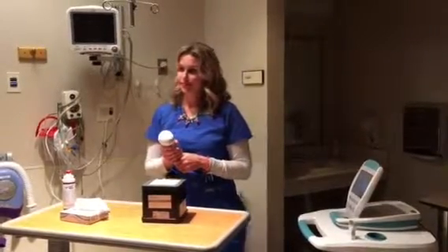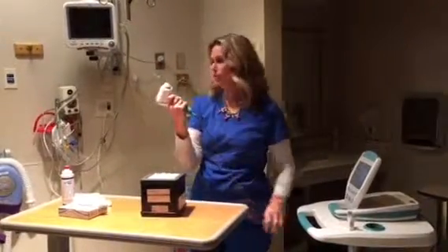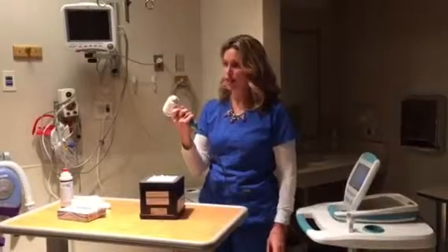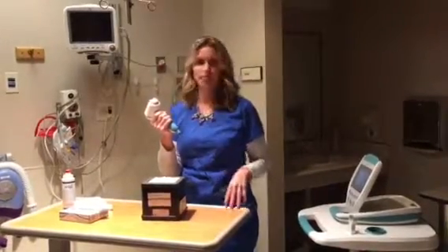There's no scan button like there was on the last one? Nope, it's just on the trigger. Yep, on the trigger this time. And you can keep holding the trigger if you prefer that. It will stop.